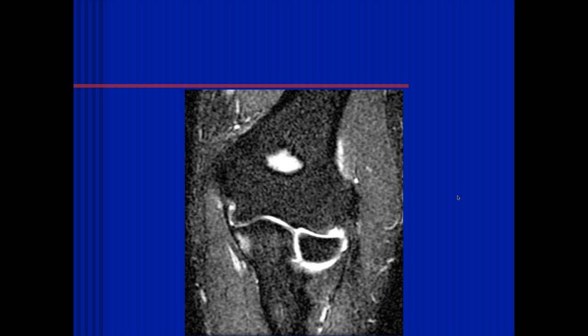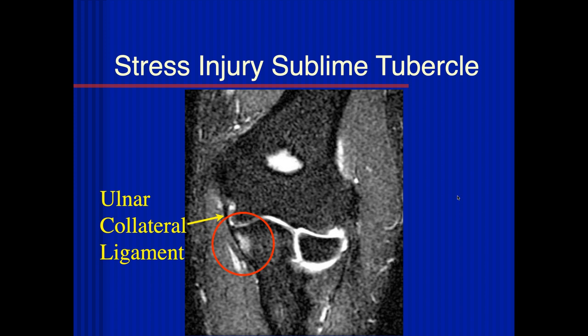Here you can again see some stress reaction along the sublime tubercle, and the ulnar collateral ligament seems intact. These are typically seen in teenage pitchers or catchers. These kids typically will have symptoms at this stage, and this is a precursor to a more significant event. This may be very helpful in managing these patients because you can't really see these by other modalities.